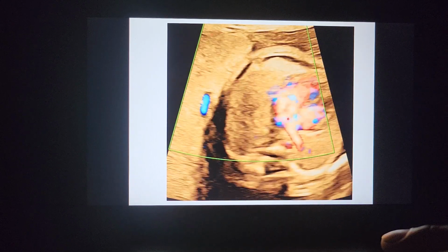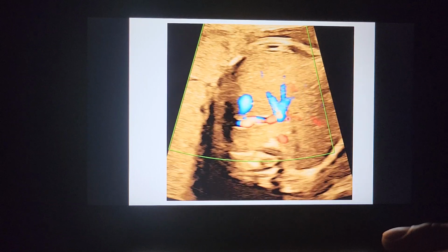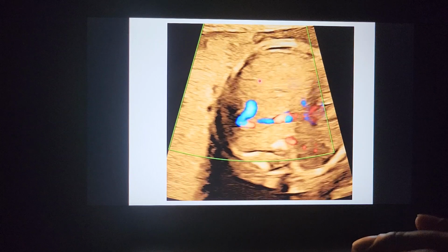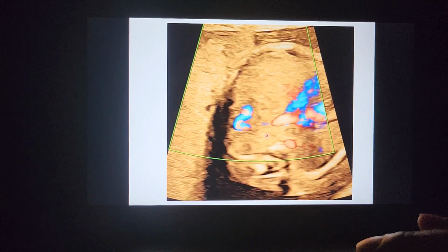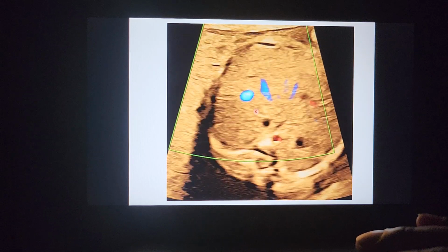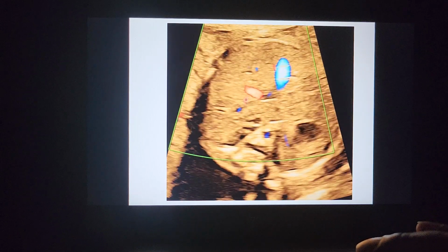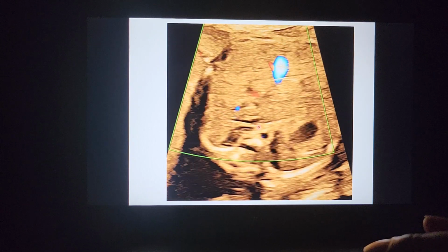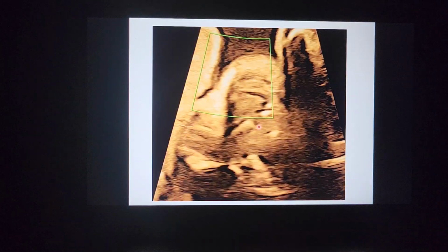So this is a portal systemic shunt in a case of agenesis of ductus venosus, and this shunt is understandable in this axial view. In the sagittal view, it is clearly understood ductus venosus is absent. In the axial view, we can show clearly the shunt between the right portal vein and the right hepatic vein as shown in this example.